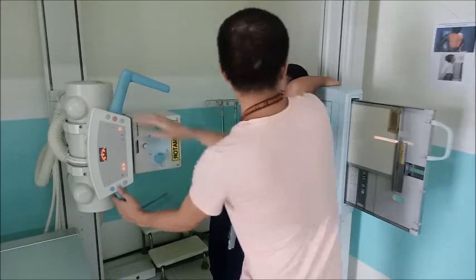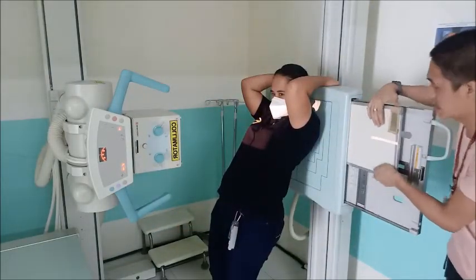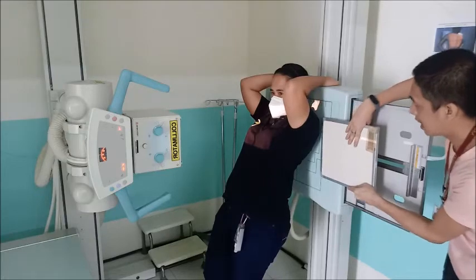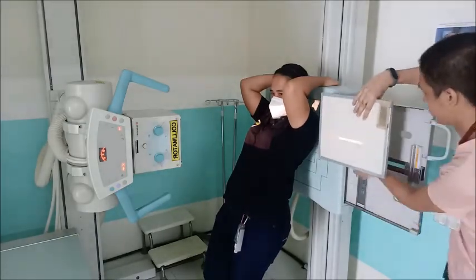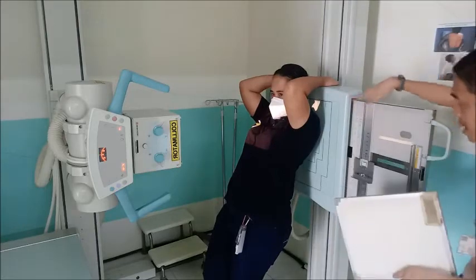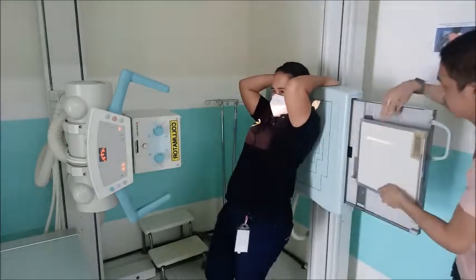Okay, so what to do? Diba, kapag na pwede natin siya adjustan. So the top portion sa atong cassette should be at the level of our C7. Muna siya ang edge niya. So pwede gihapon, malibog mo sa yung C7, then the top of the shoulder.